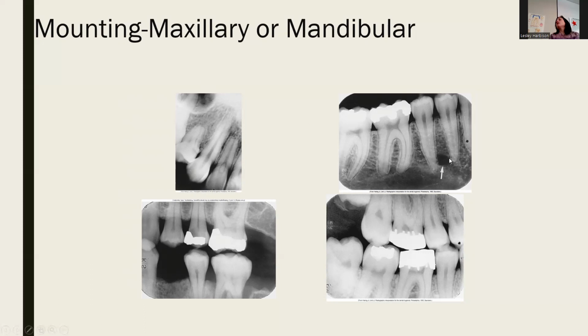And then what about this one here? What's this shot? Mandibular or maxillary? And what do you see there? 2 roots. And what else? Anything else? Oh my gosh, yes. That's the mental foramen. And this is the submandibular fossa. See how it looks a little thinner right through there? So that's the submandibular fossa, and that's another thing that you'll be tested on with the landmark.